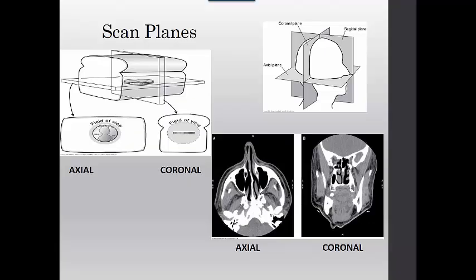And images taken in an axial plane show only sections of the anatomy with no view of the entire ethmoid complex. So images taken in the coronal plane are more suitable for displaying the ethmoid sinus structures and more readily show any kind of obstruction. And you can see here that there are some pretty inflamed turbinates in the sinuses, so you don't see that here on this image.